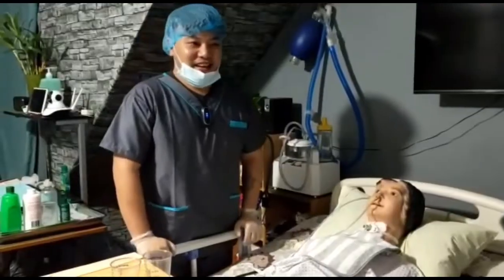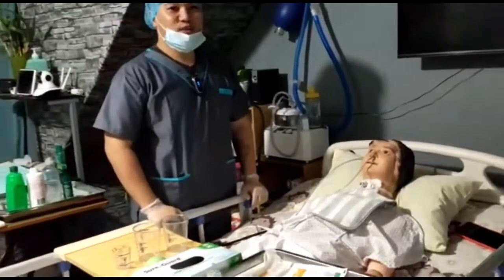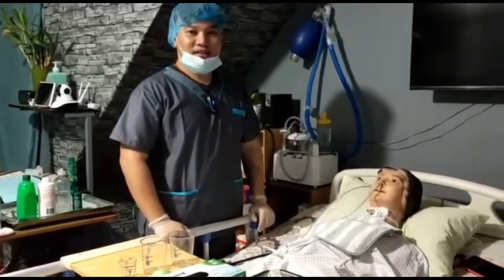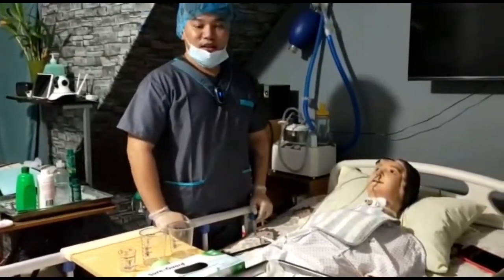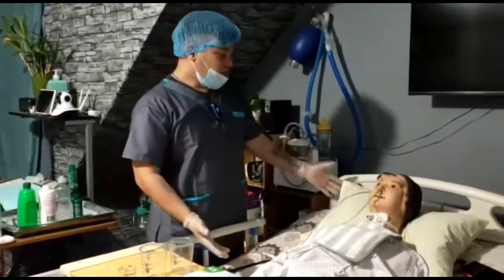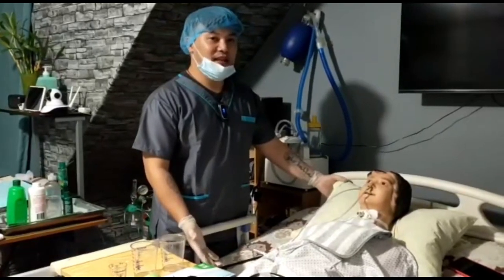Hi guys, so ngayon naman is gagawin natin kung paano magpakain through NGT feeding. So, NGT po is nasogastric tube feeding. And meron po tayong tatlong guides na ginagawa. Number one is positioning. So, make sure na yung pasyente natin is nasa semi-Fowler's position or 45 degrees angle.